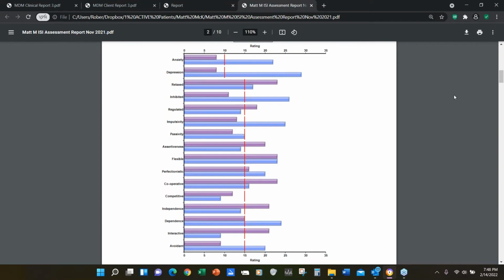So yeah, I was thinking about the way I've evolved in terms of going over maps, because I used to go over every single thing and every little dot. And I realized that it's hard for people to capture, like they're coming in overwhelmed either about themselves or about their child, and they leave sort of flooded. I've been taking a lot of classes now, and I've been noticing different presenters. Some people jam in an 8-hour class, and every slide is jam-packed with information. I pretty much remember nothing of what they've said.